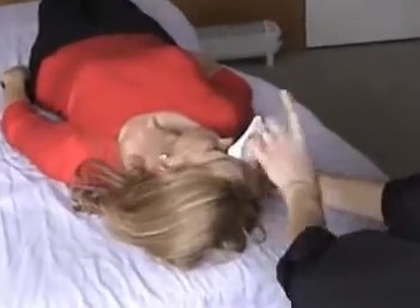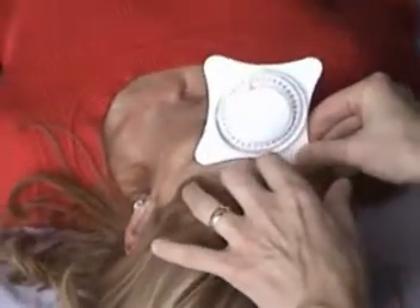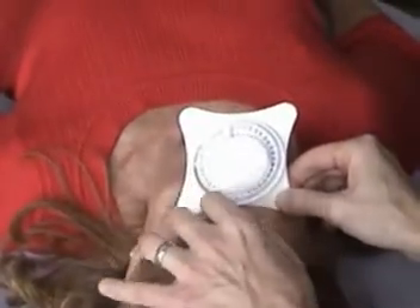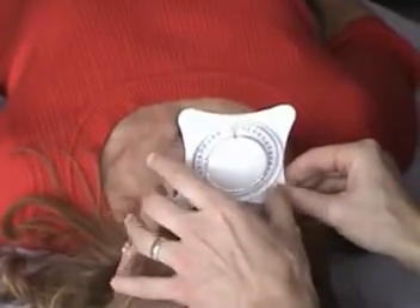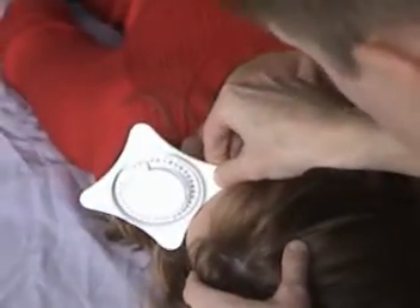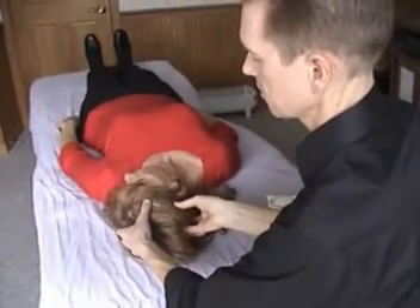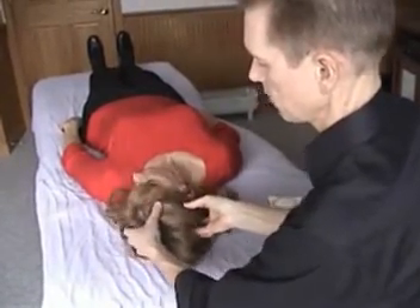Marsha's doing 80 degrees of rotation. The only thing that's difficult is, when the person rotates to the left — that's also 80 degrees of rotation — just make sure that they're doing pure rotation, that they're not also doing lateral flexion, or in some cases, a little forward flexion.